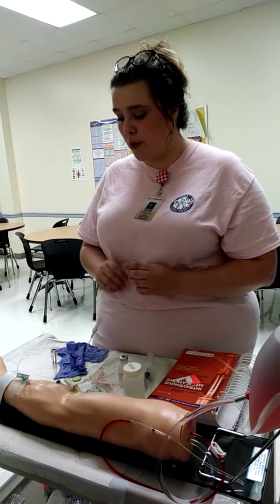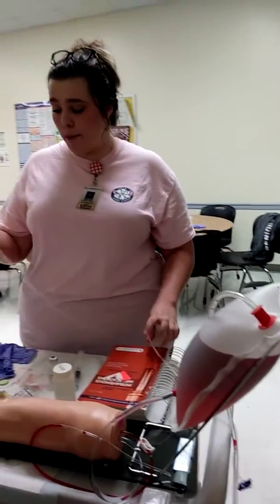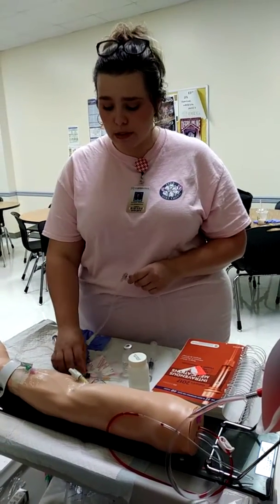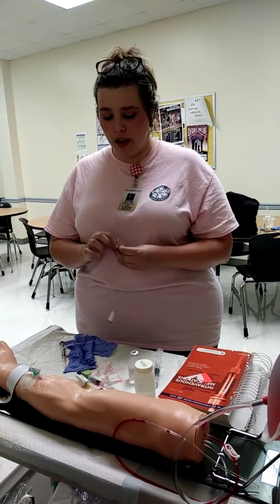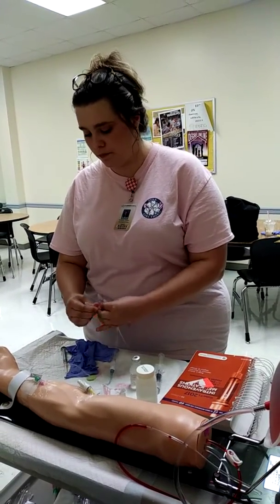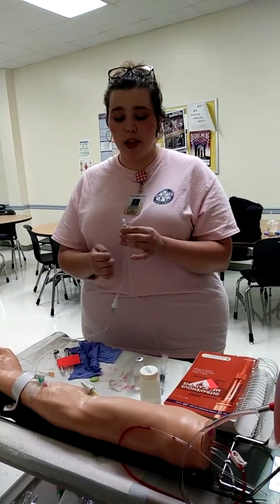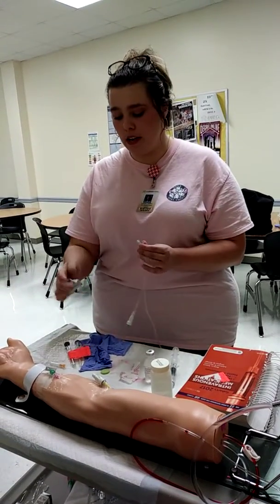So now what I'll do is I'll go ahead and check my IV. I could clamp it if I need to, if it wasn't compatible, but since furosemide is compatible with this, I'll go ahead and get his line. I'll clamp it just like this, get my medication. All right, I'm going to clean this. The reason I'm clamping it is because the medication has opportunity to go back through here, so we want it to go straight through the vein.